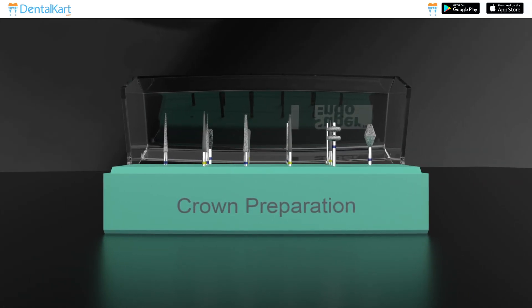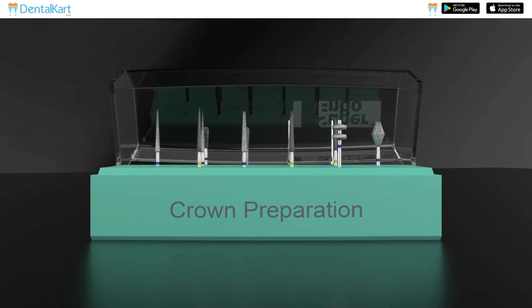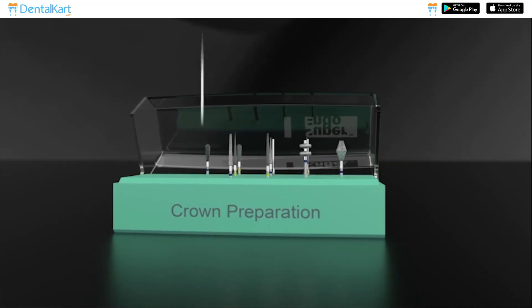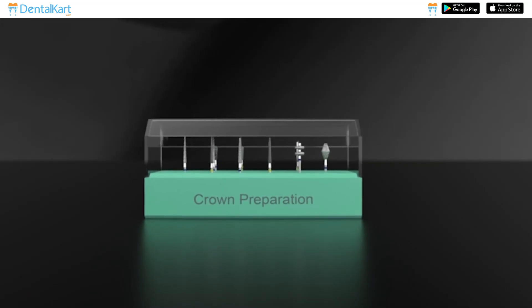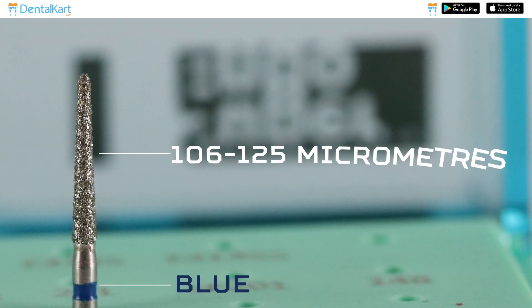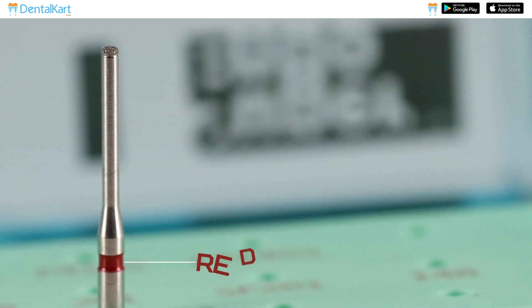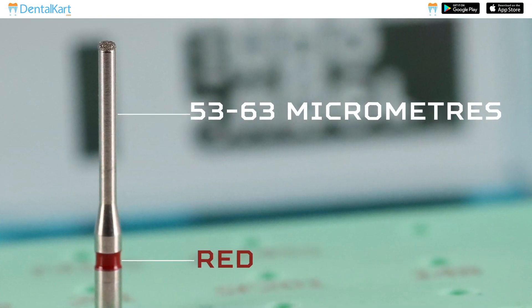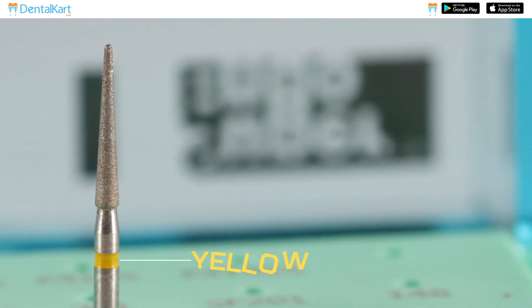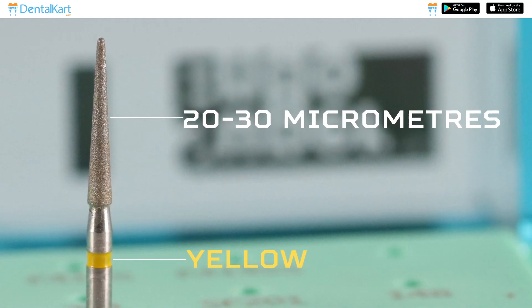Super Endo Crown Preparation Bur Kit is a high quality, professional grade set of burrs specially designed for crown preparation. It contains 14 diamond burrs with different color coding around their neck according to their purpose. Blue color standard burrs have a particle size of 106 to 125 micrometers. Red color burrs are fine grit burrs with a particle size of 53 to 63 micrometers.